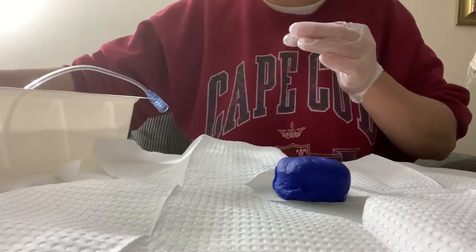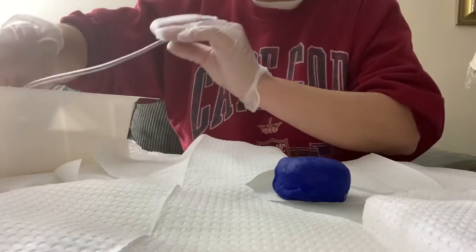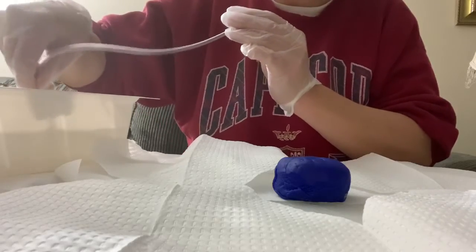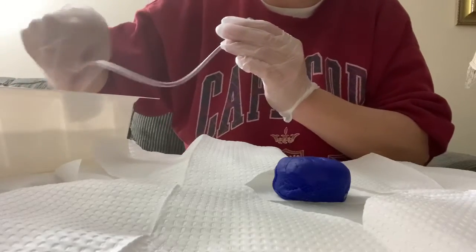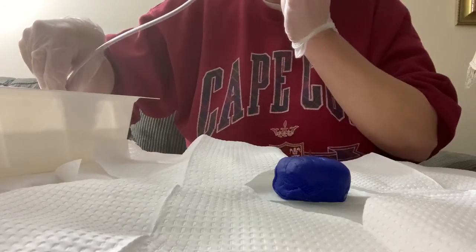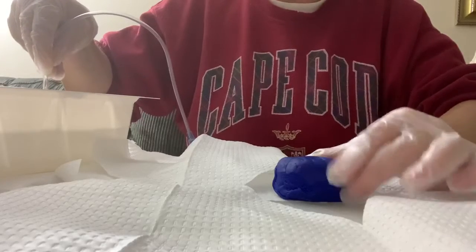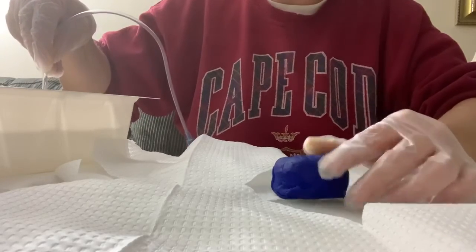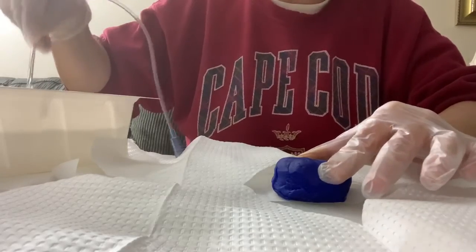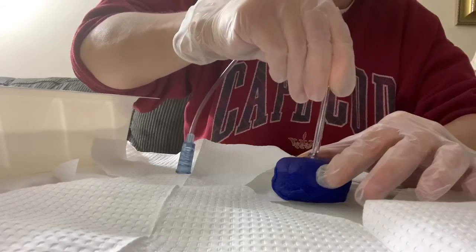And then finally, now that the area is clean, I'm going to take my catheter, which has been run through the lubricant that I placed in my sterile tray, and very carefully, without touching the patient's skin, with my non-dominant hand, I'm going to spread the labia, and then I'm just going to carefully insert the catheter.